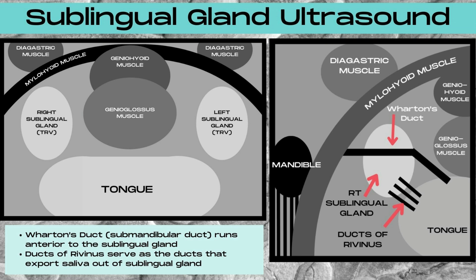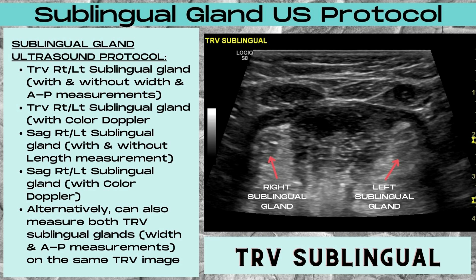Anterior to the mylohyoid muscles are going to be the anterior body of the digastric muscles. On the image to the right, you'll note that Wharton's duct travels anteriorly over the top of the right sublingual gland in the transverse plane. This is why stones within Wharton's duct — which is actually the submandibular duct — can commonly be mistaken for stones within the right sublingual gland. Note the placement of the ducts of Rivinus, which connect the right sublingual gland to the tongue to export saliva. A true sublingual stone at this location would be rare; more commonly you'll see a submandibular stone within Wharton's duct mimicking the appearance of a sublingual stone.